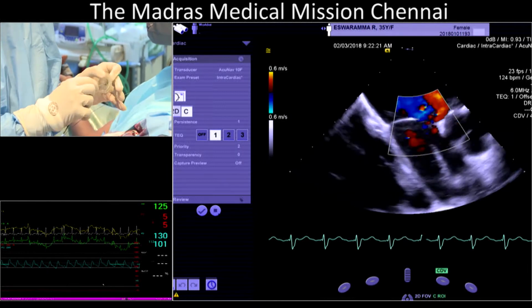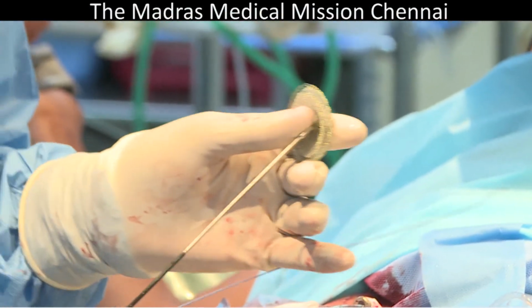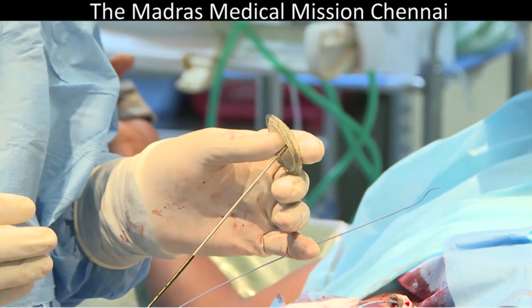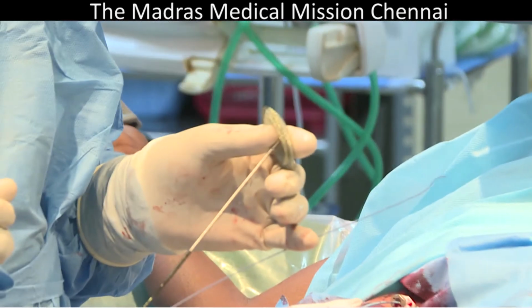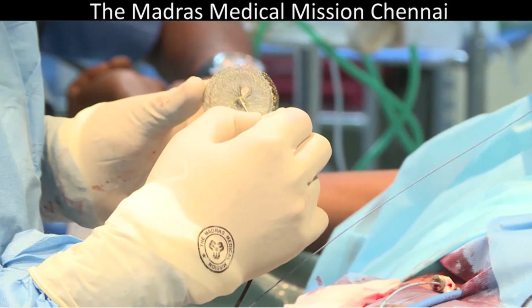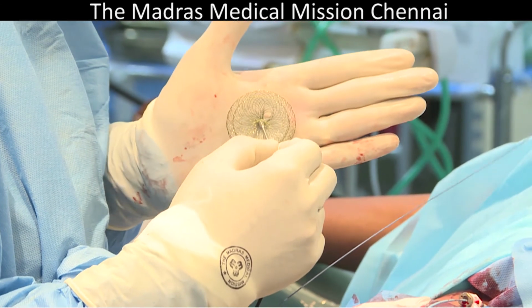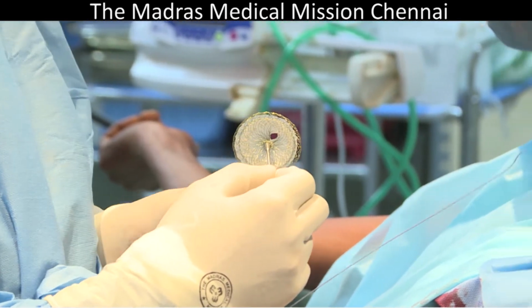Focus on the device. So what have you done so far? See, the echocardiographic measurement of this hole was around 23 to 24. So we decided to use a 27 Occlutech fenestrated device. Yeah, are you able to see the fenestration? Yep, I'll show my finger. Take your hand away, I think we see it better without your hand. Okay, fine. But there you go.